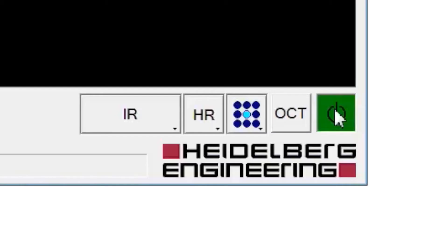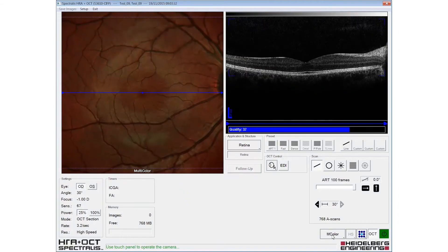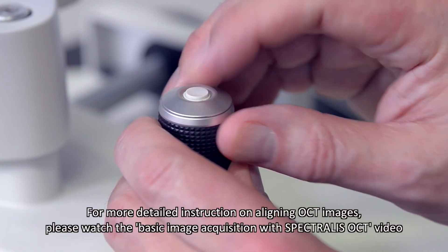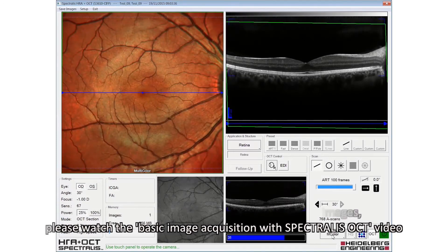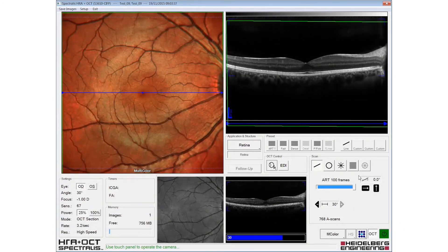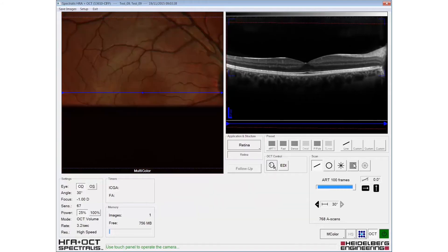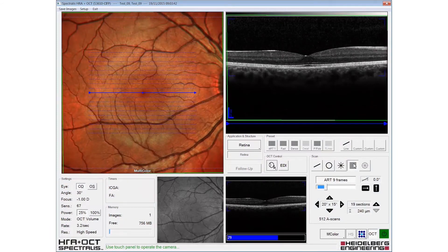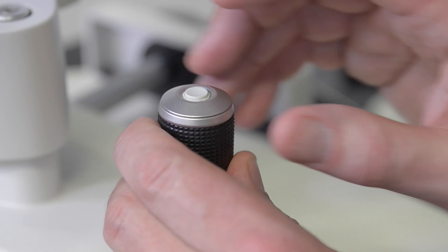A simultaneous multicolour and OCT scan can be acquired by selecting the OCT mode. Eye tracking and automatic real-time is engaged with a long press of the joystick button, and a short button press acquires the image. Volume scans are acquired in a similar manner, requiring only a short button press to acquire the image.